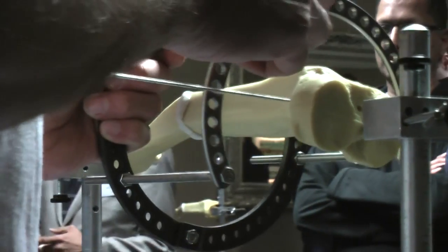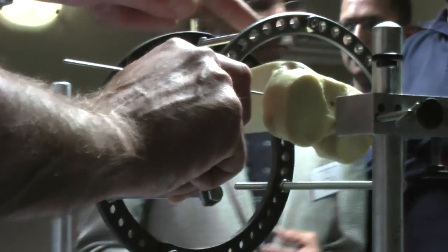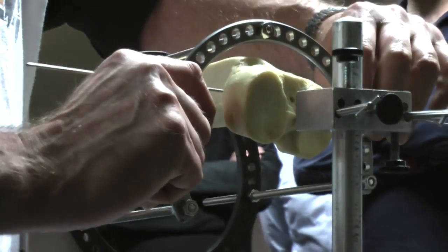I say, if you look at the couple that we built, it's basically a 5/8 ring, because I always use a 5/8 at the top of the tibia. And I've put this rod essentially straight down the front of the frame, because that lets you line it up on the tibia. If you look at that there now, it would be really nice if you could, Owen.